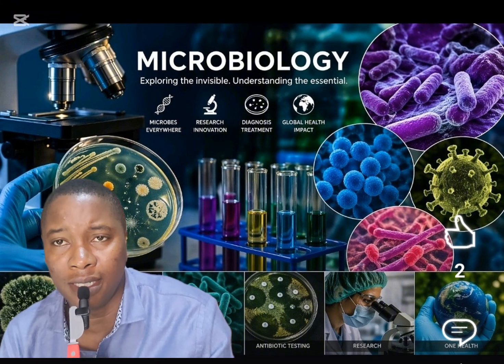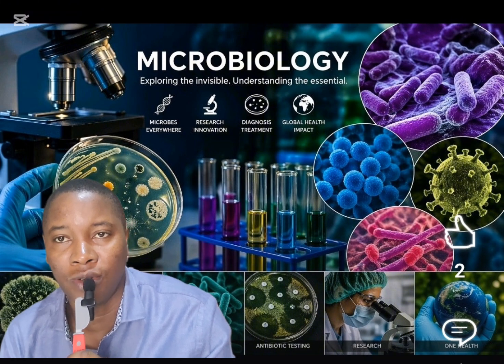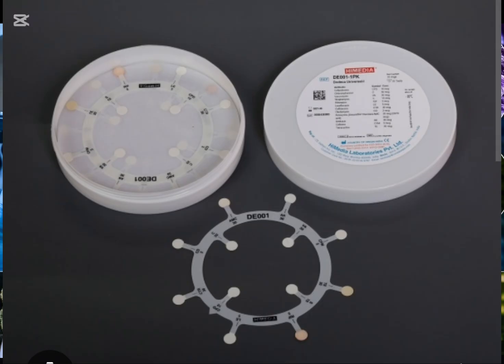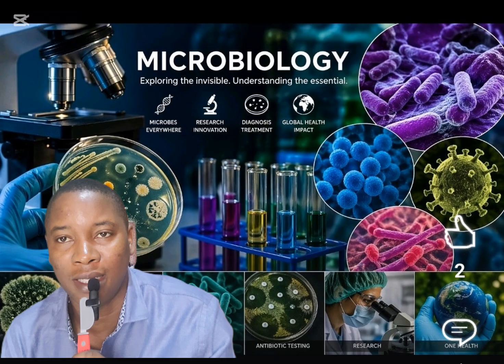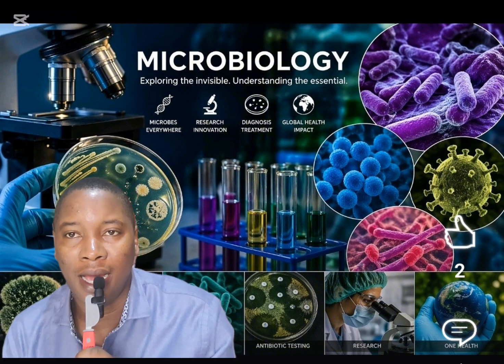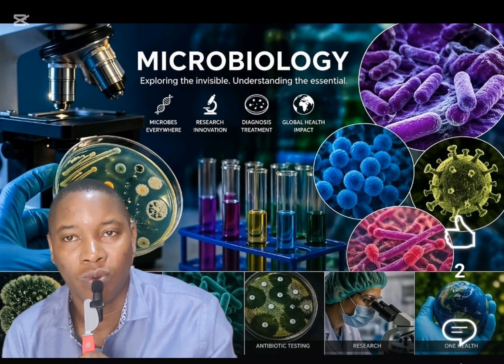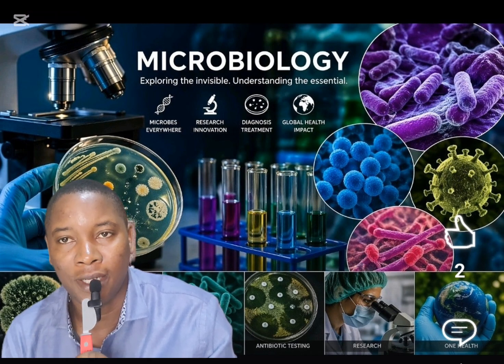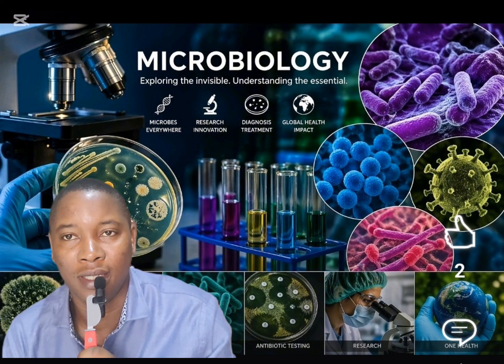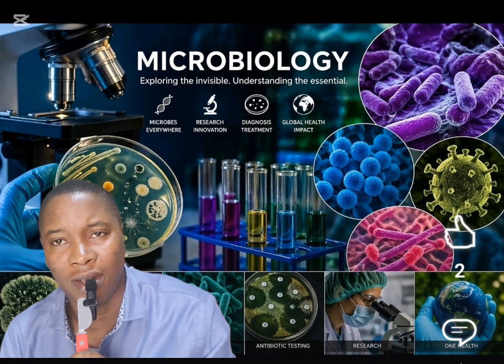And what is it that we are reading in this? When you have incubated and allowed these antibiotics to work, and your bacteria has been grown in a petri dish, you now need to look: is there what we call a zone of clearance? That means, has this antibiotic been effective against the bacteria? If it's been effective, you notice that it is able to clear places on the plate. So that clearance tells you that the antibiotic is effective in combating the pathogen. Now, if you don't have such a clearance, then you know that the antibiotic was unable to fight against the pathogen. So this is a very important test.